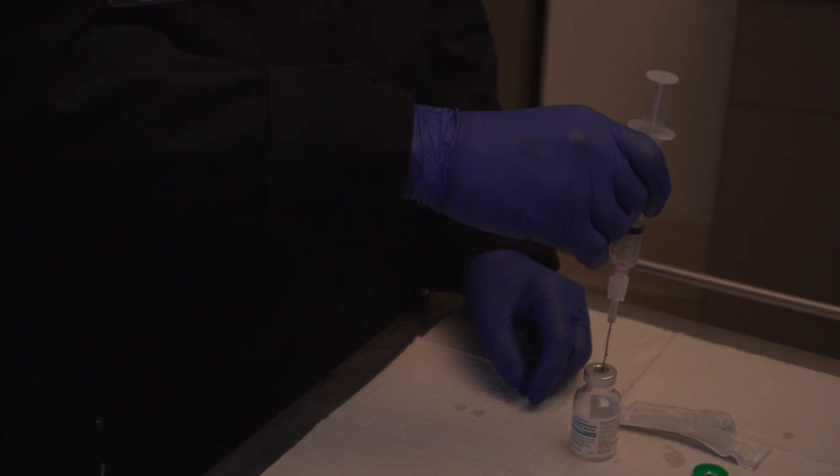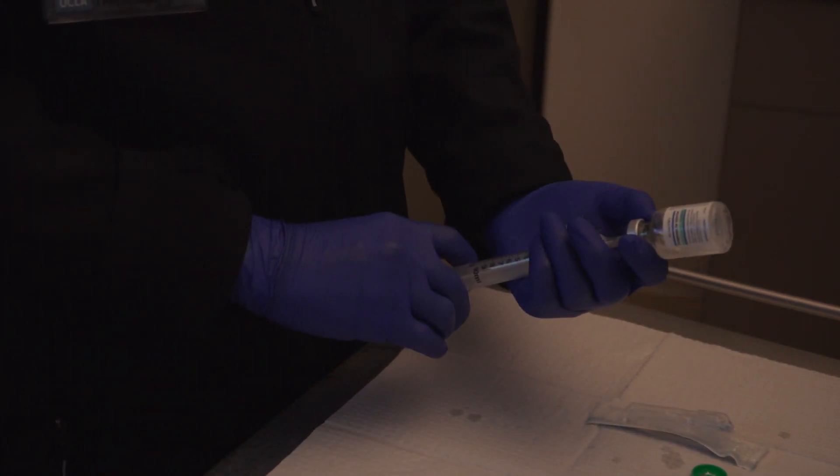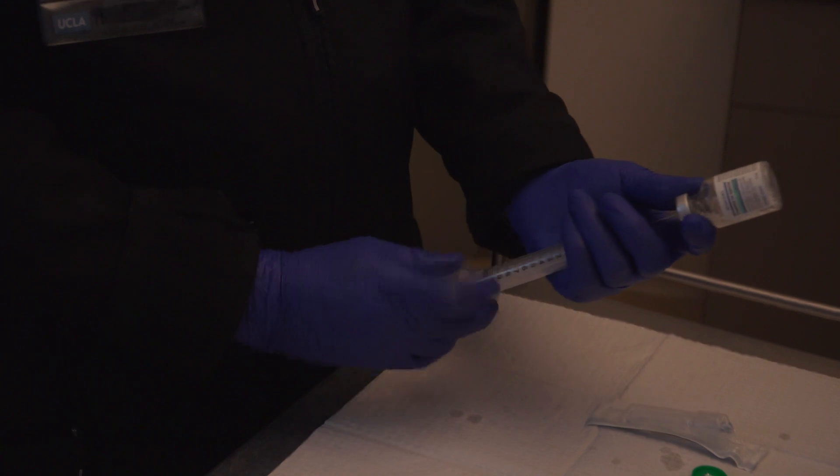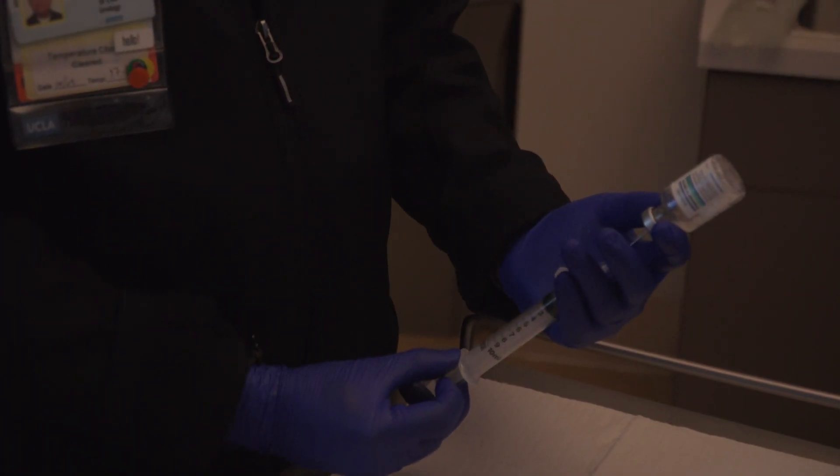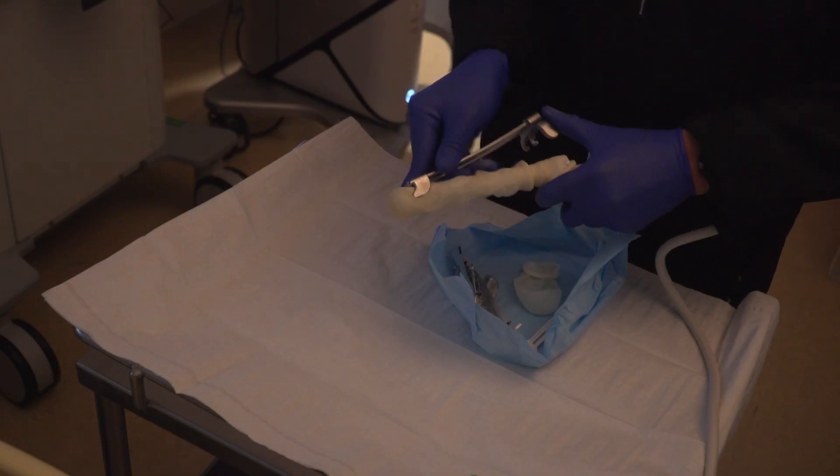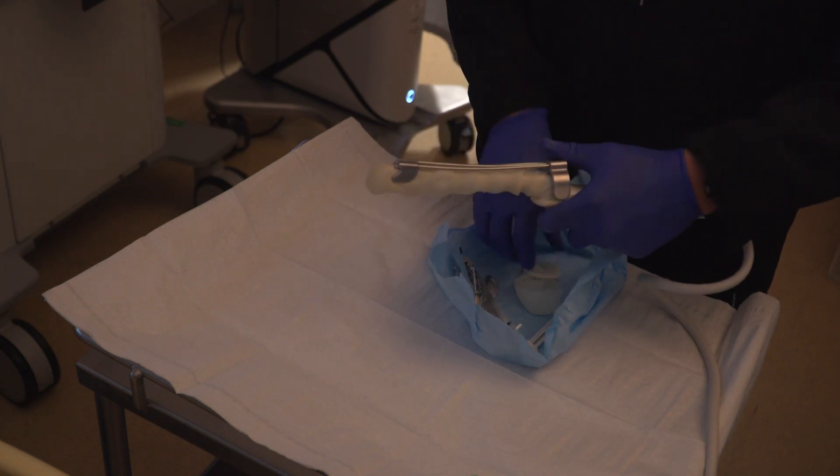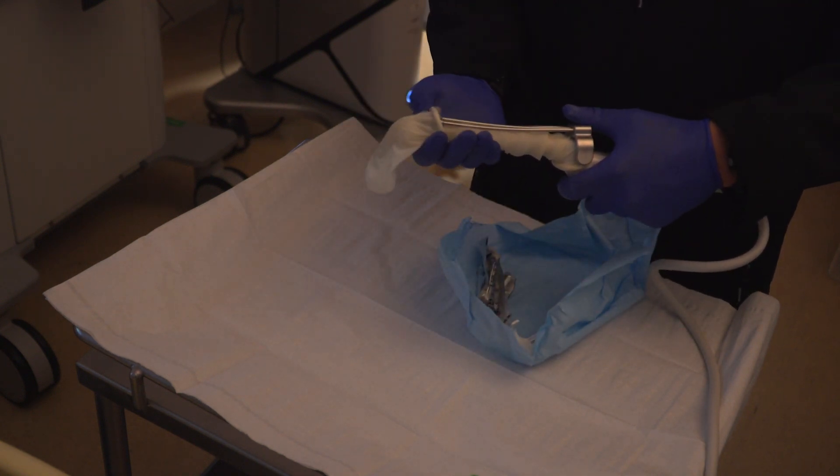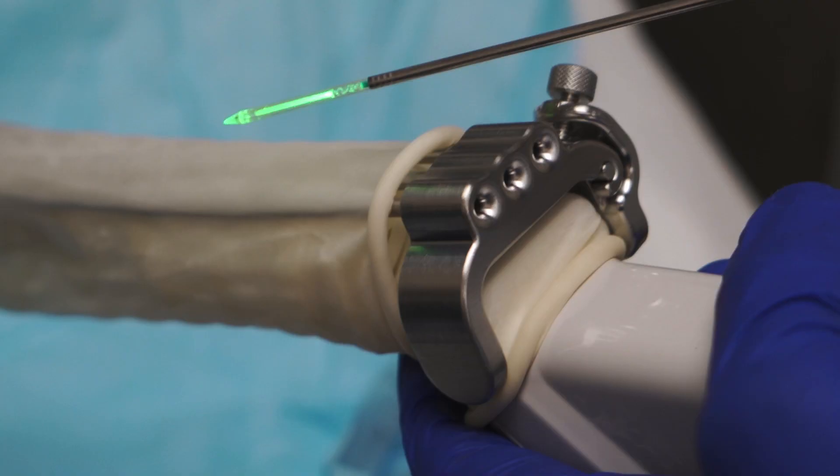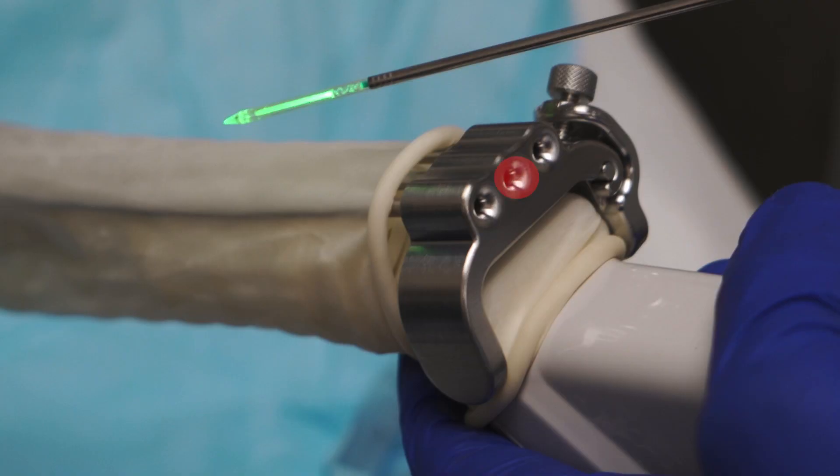60 minutes prior to the procedure, patients receive antibiotic prophylaxis, oral acetaminophen, and intramuscular Ketorolac. The multi-channel guide is placed over the ultrasound probe in a similar fashion to setting up a biopsy guide. The center channel of the guide is for placement of the laser catheter and for anesthetizing the prostate. The lateral channels are for placing the thermal probe. The right and left orientation will change depending on the treatment plan.